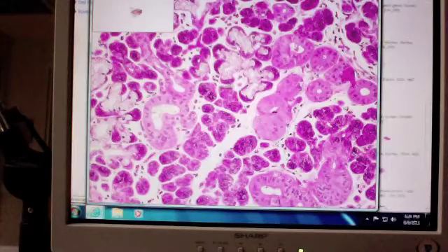This little half-moon structure sitting up on the surface of these mucus-secreting cells is called a serous demilune. Okay. My pointer is in the lumen of what structure of this gland? The duct. Very good. Right, you can see, so here we actually have quite a few cross-sections through ducts. We have quite a few acini that are purely serous, then we have these mixed acini that have both serous and mucus.